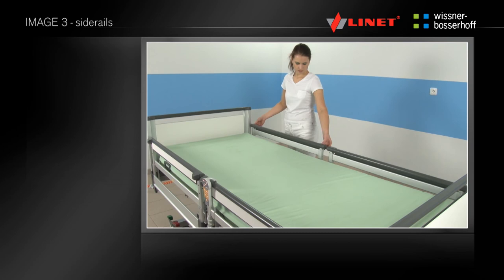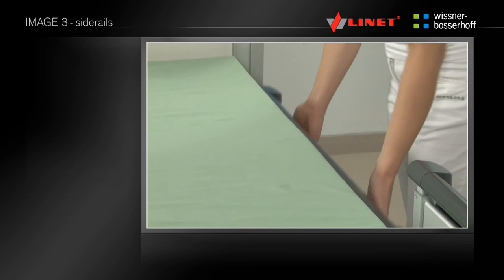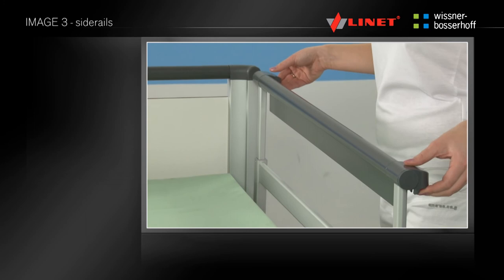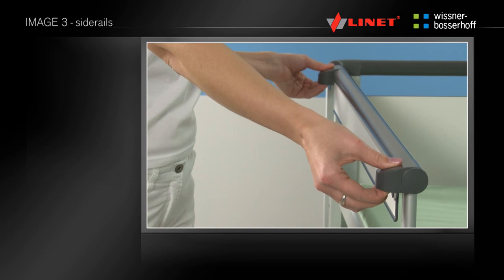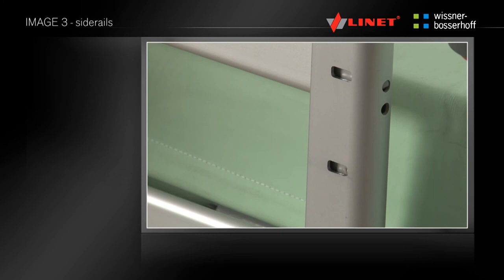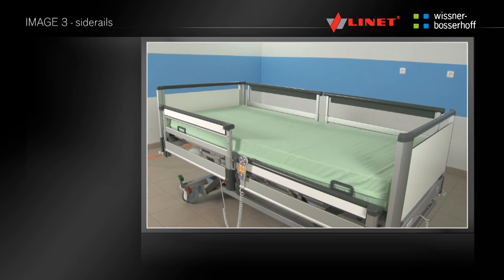When the patient is unattended and on the bed, the side walls must be raised to the upper position. At the mobilization of the patient, the side walls can be locked and inserted by a simple procedure. Each side rail has two locking buttons located on the sides at the bottom of the handles. By simultaneously pressing and shifting, the side rail can be set to several height levels. A click indicates the latching of the side rail. After setting the side rail, always make sure it is properly latched in a horizontal position.